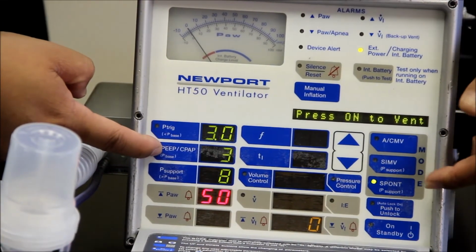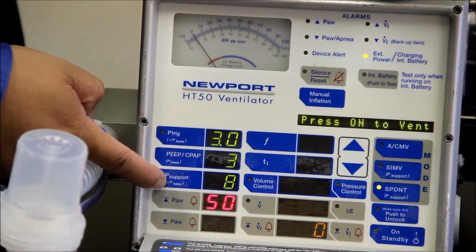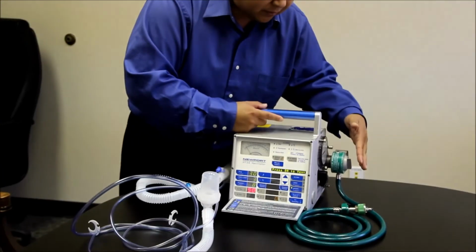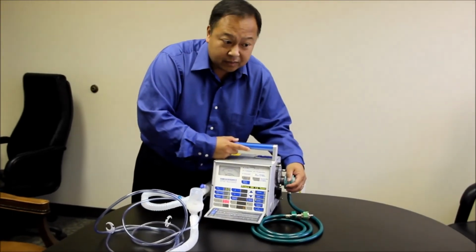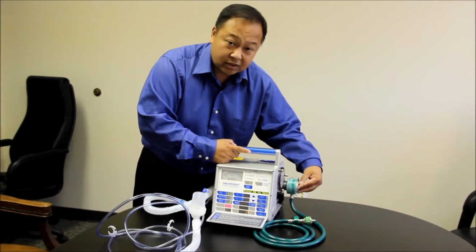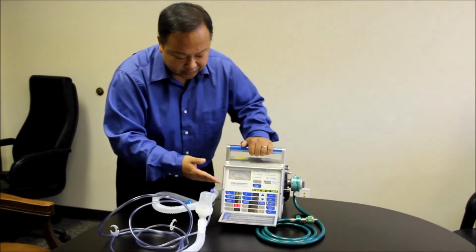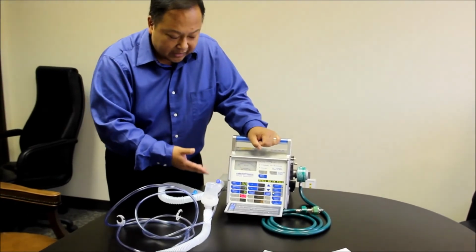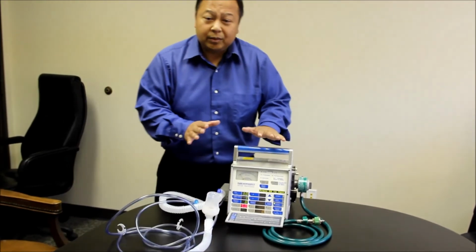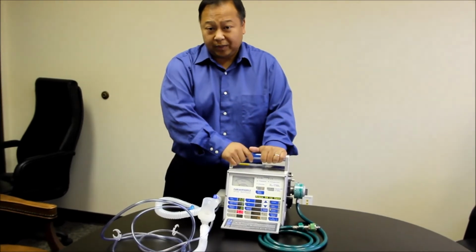PEEP, on spontaneous mode, allows the airways to remain open even after they exhale, and pressure support allows them to compensate through the tubing. And the other thing that stays the same is the oxygen. Oxygen is kind of independently controlled, so no matter what setting the patient is on, the oxygen that we're providing can be adjusted the entire time. Okay, so that's the difference between AC mode, SIMV mode, and then CPAP or spontaneous breathing mode. Those are the three most basic volume modes that we use for our patients.